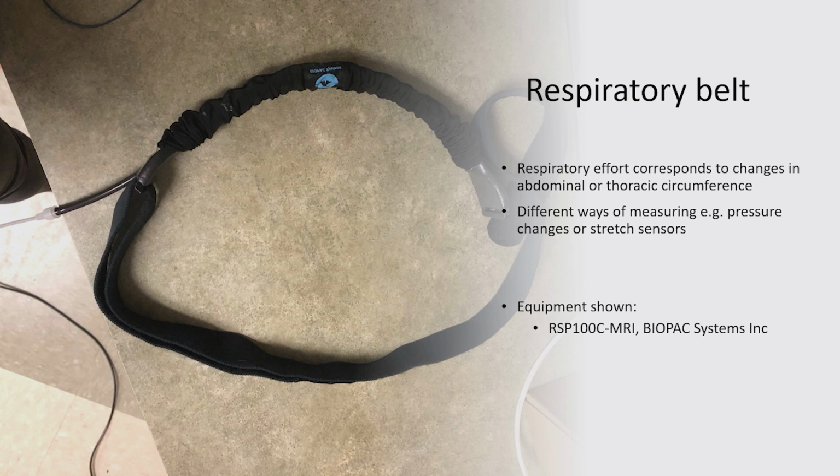It's essentially a tube that goes through there, and it's a sensor that will respond to the abdominal or thoracic circumference. As Meryl talked about, you can put it on your chest, you can put it on your abdomen. That is very dependent on a lot of different factors. For us, typically we find the best response with the respiratory belt if it's right below or right on top of the chest. It also depends on the person that you're scanning and what they're comfortable with. But I really recommend that you test this out.